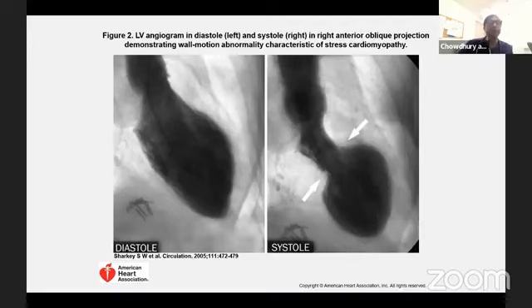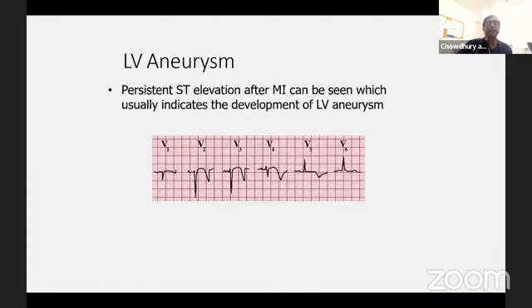It is usually only 2 conditions, the MI or significant myocarditis. So troponin is not a binary thing. The magnitude of troponin rise also indicates where the problem is. And you need to look at the EKG, look at the patient, look at the echo, and then decide what to do.